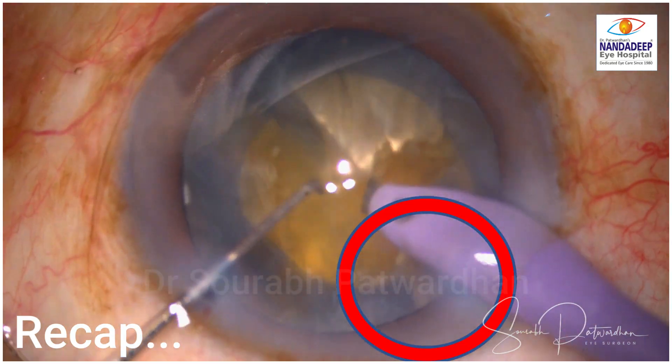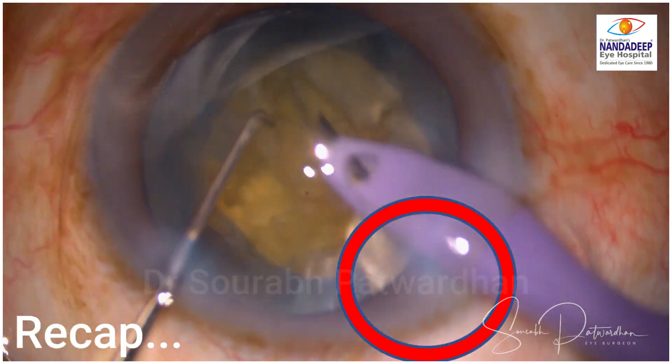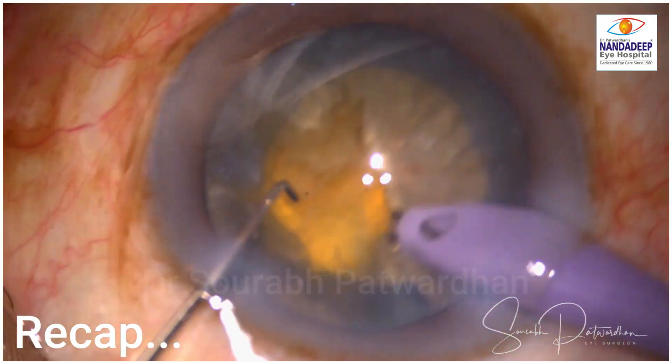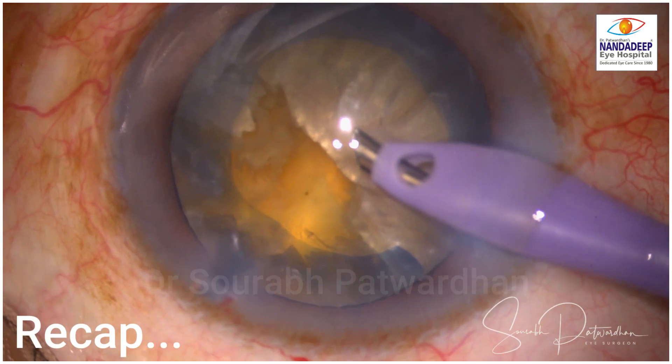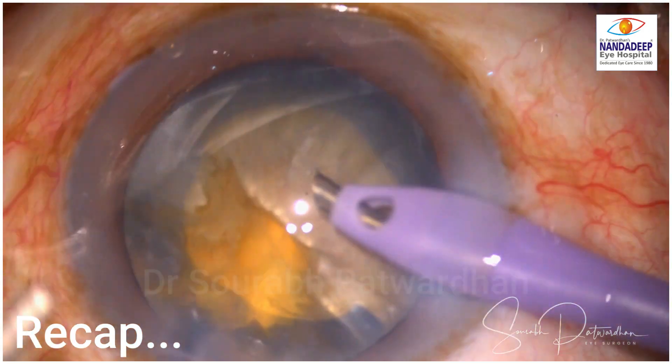There was a radial tear during the nucleus management and as I continued with the procedure, this tear must have gone to the posterior capsule — that's why you can see the tilting of the nucleus. I realized that there is a posterior capsular dehiscence, so I stopped the surgery.